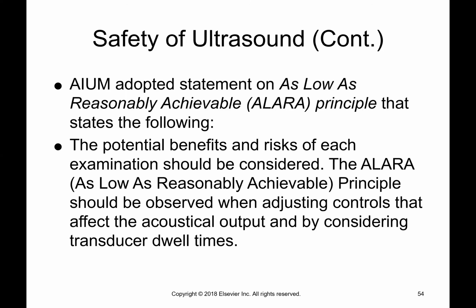So you don't want to stay on one part of the baby forever and ever. You want to continue to do your scan, but just be present and know that you are scanning. The bioeffects are probably fine. They've done studies, they haven't seen anything yet, but you are doing something outside to the fetus. So you just want to be careful with how much ultrasound you give the baby.